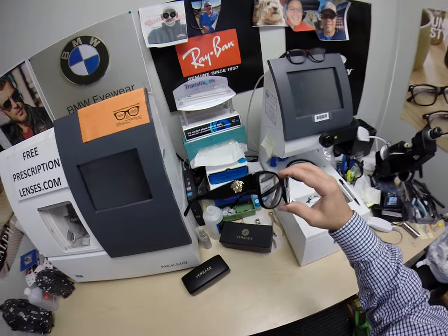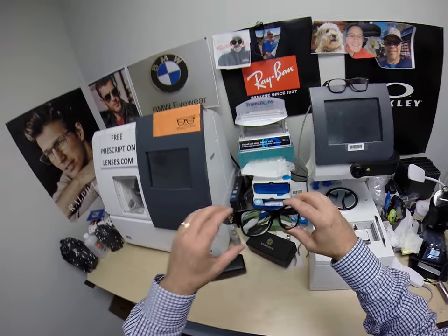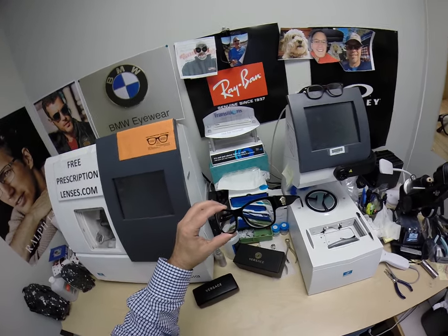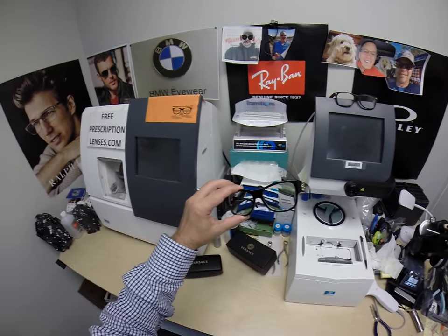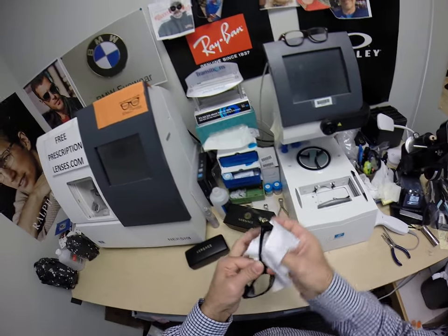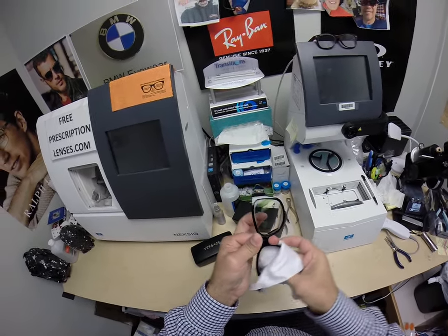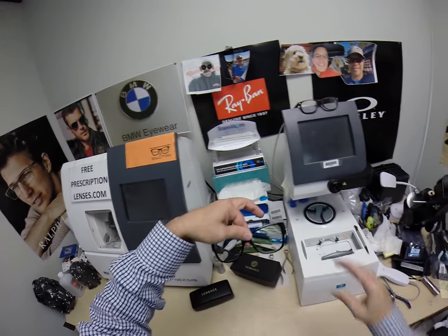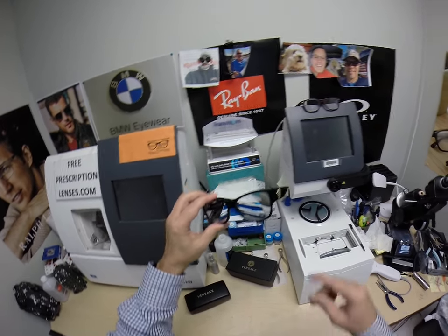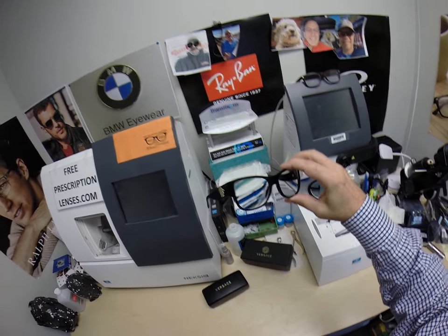You get one free pair of clear single vision prescription lenses when you buy the frame. You can upgrade to the Transitions Extra Active, any type of Crizal anti-glare coating that you want. These are shown with the Transitions Extra Active, and I can get them as polarized sunglasses — I can do just about anything you want. This is what they look like before they have been activated. These have 8 diopters of astigmatism correction.